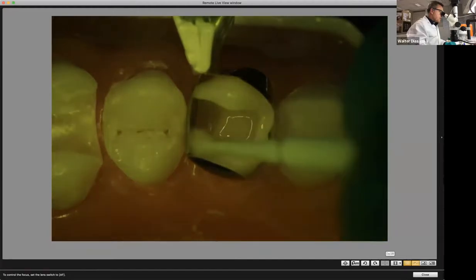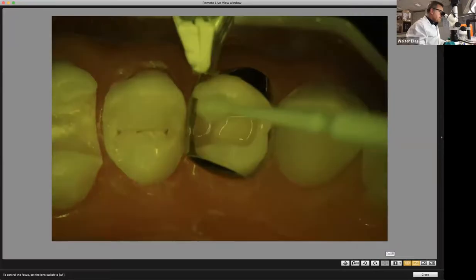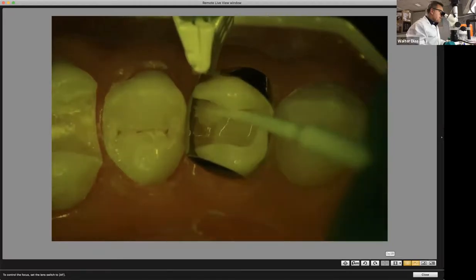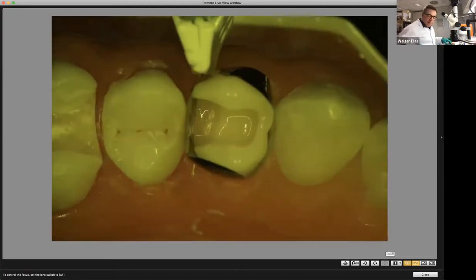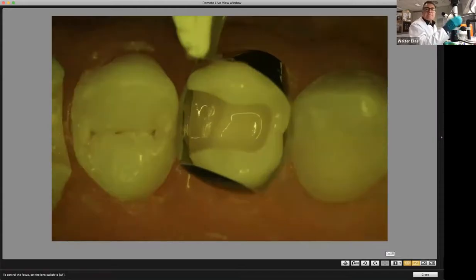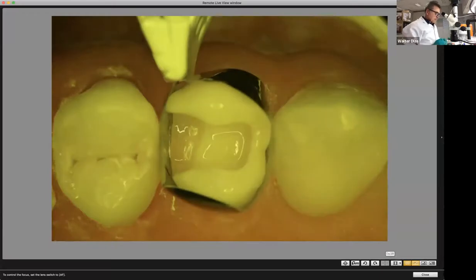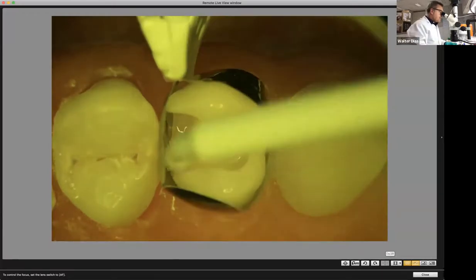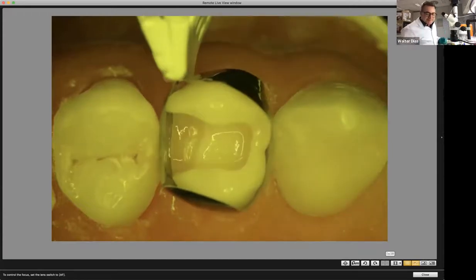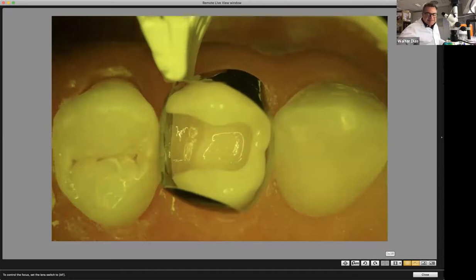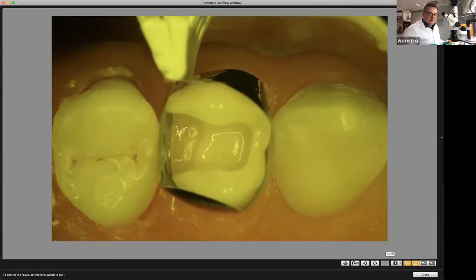You already know the drill: if this is total-etch, you have to massage everything for 20 seconds. If it's selective etching, then massage the dentin you did not etch — but you still need to respect those 20 seconds. Then use a dry microbrush or a paper point to remove the excess. Then dry this for 10 seconds. If you do five seconds, good on you — you're already improving the quality of your adhesive technique 10-fold, getting much more reliable and reproducible results.